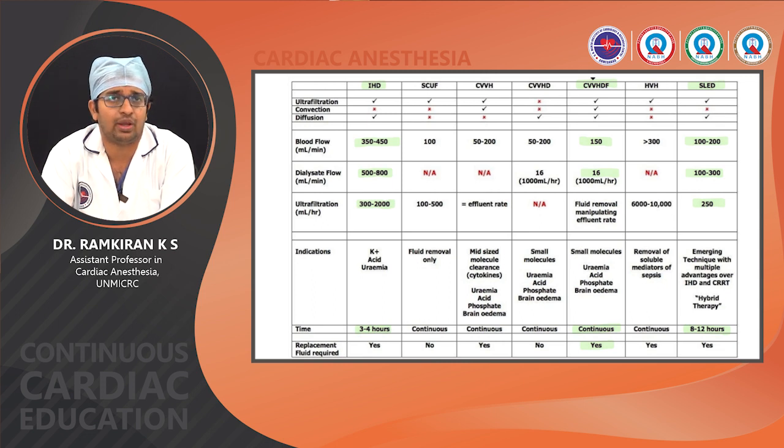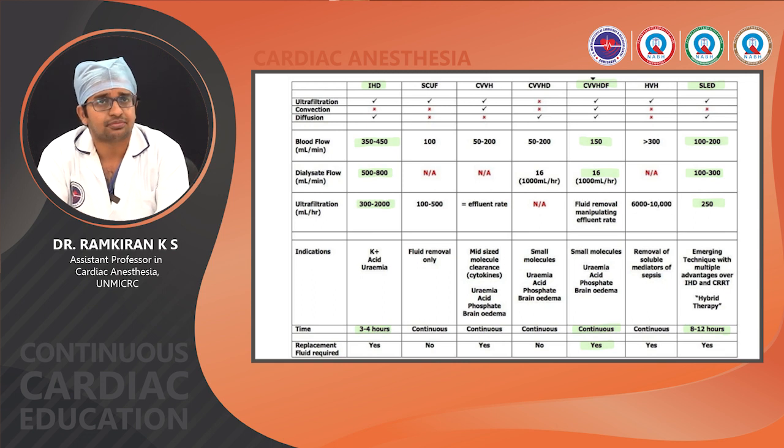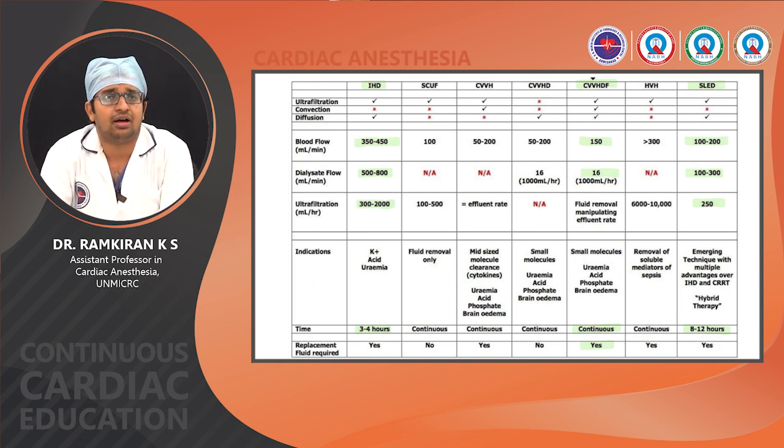So it needs a very high flow rate, a high flow of blood as well as a high flow of dialysate. And you can do some filtration, which can filter up to almost 300 to 2000 ml per hour. So basically it is done in approximately 3 to 4 hours. Now if you take CVVHDF, here the blood flows, definitely it is done over a long time.